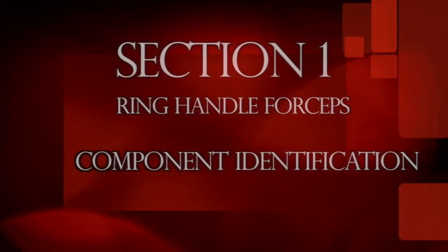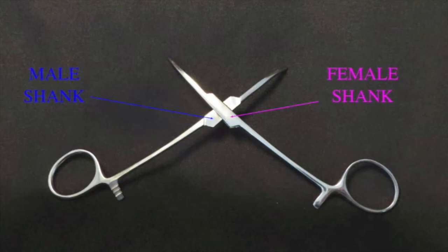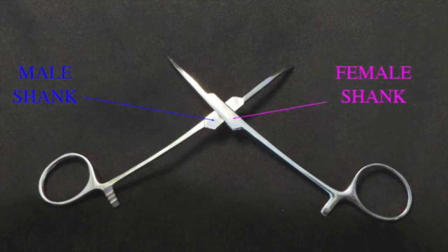Section 1: Ring-handled forceps component identification. Ring-handled forceps are composed of a male and female shank that are joined together at a pivot point known as the box lock.